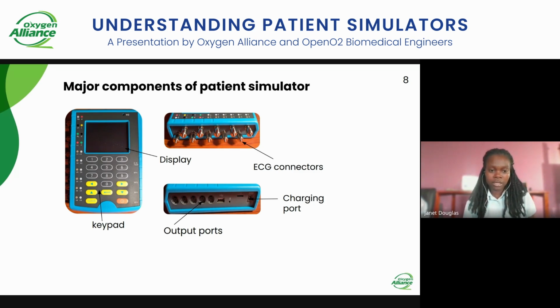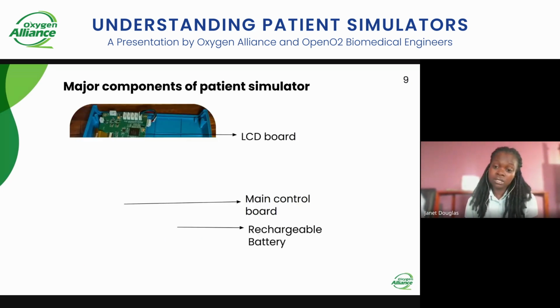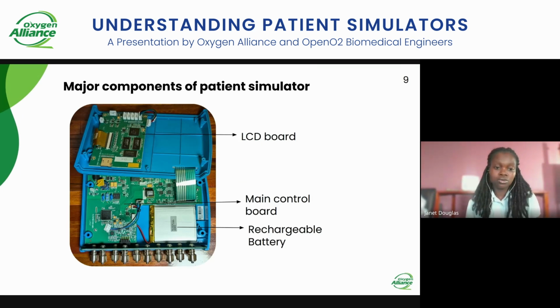Looking at the internal parts, mostly when you open it, you will find 2 boards. There's a board for the LCD, and there's the main control board that is responsible for controlling all the activities that happen within. If you're trying to navigate through the simulator, this is the board that actually controls everything. And you also have a rechargeable battery inside.